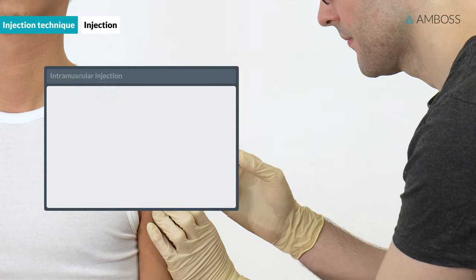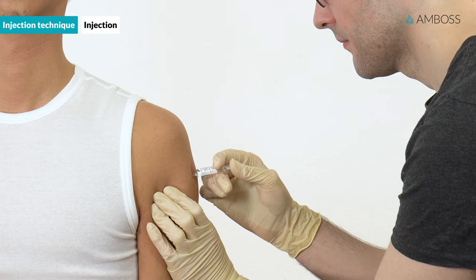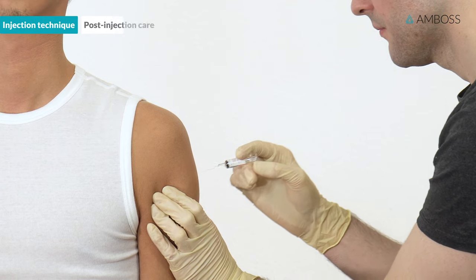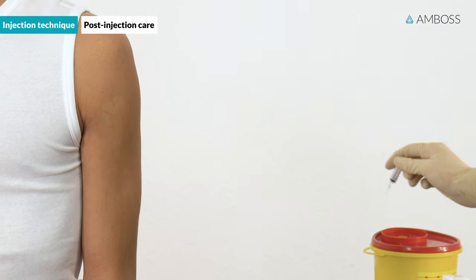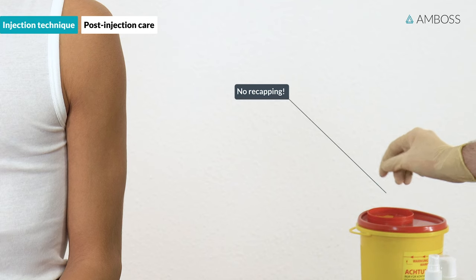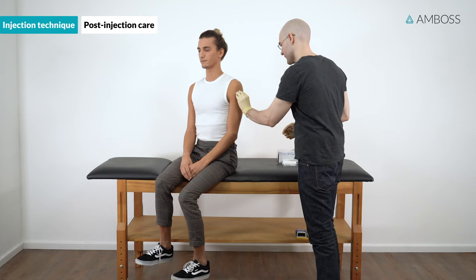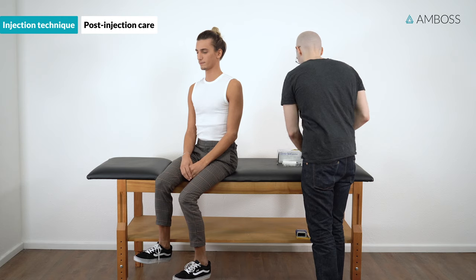Aspiration before injection is no longer considered necessary, so quickly inject the syringe content. Remove the needle and dispose of it by dropping it into the sharps container immediately. Don't attempt to recap the needle. Wipe off any escaping liquid before applying a bandage to the site of the injection.